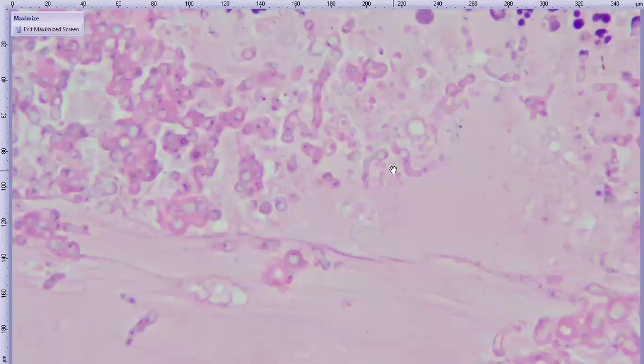Ah, there you go. And Brakel pipes up again and just says, just curious if the non-viable organisms are PAS positive. We had a discussion about this earlier. We don't know, Brakel, maybe we can report later. Yeah, we'll throw a PAS on this and we'll let you know. And Leandro wants us to comment on something, which I believe you're getting to, but you're beating around the bush. Okay, yeah, all right, let's get to it.